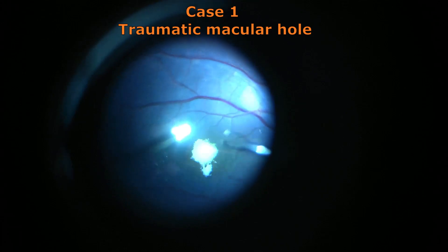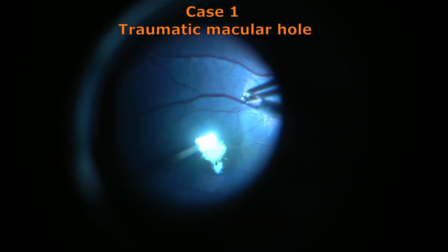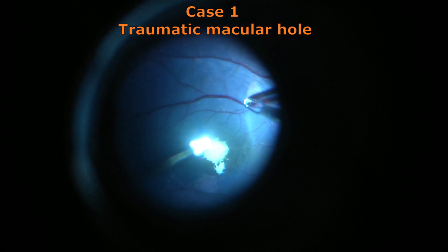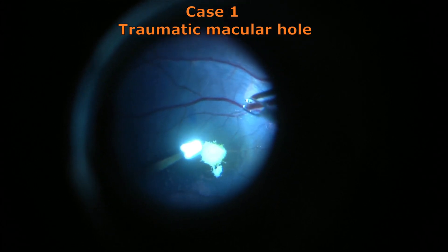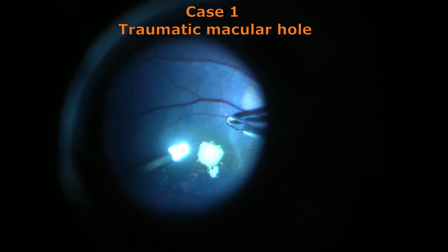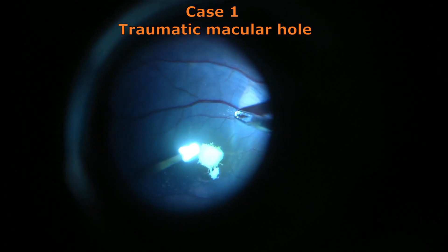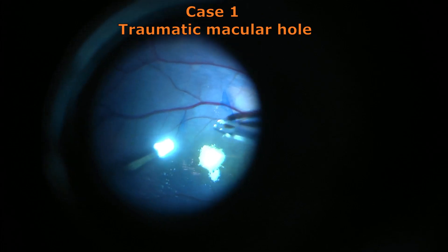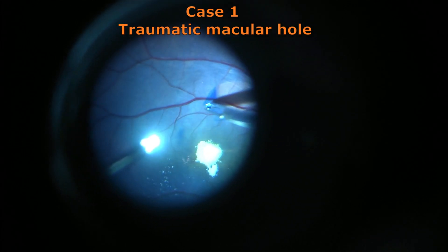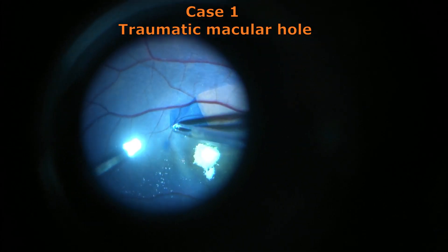These forceps are excellent in consistency and design and they never fail to provide a wonderful grip and a very precise hold when you are trying to grasp your internal limiting membrane. Here you can see a flap has been raised and using that edge one has now started peeling a large area of ILM.